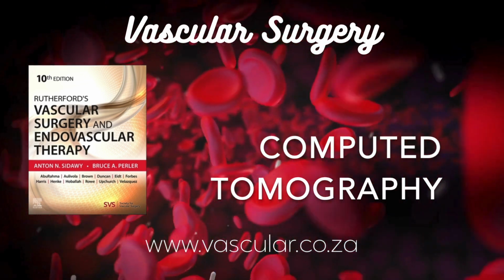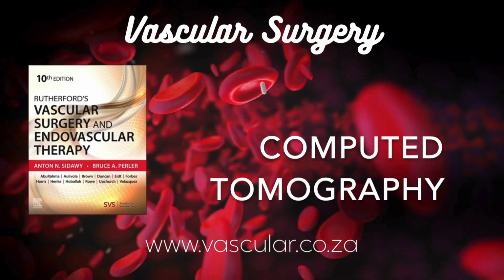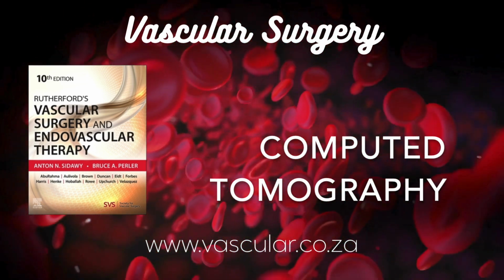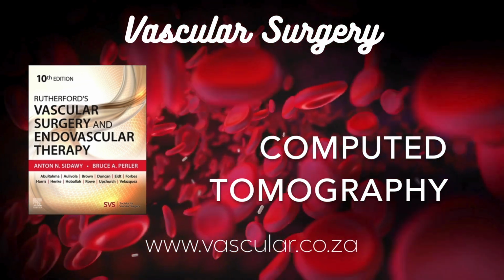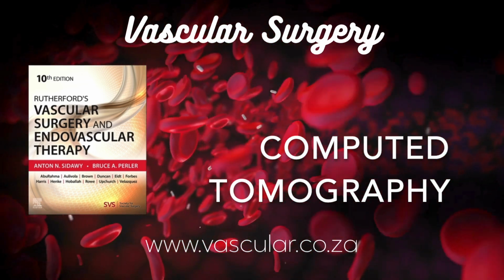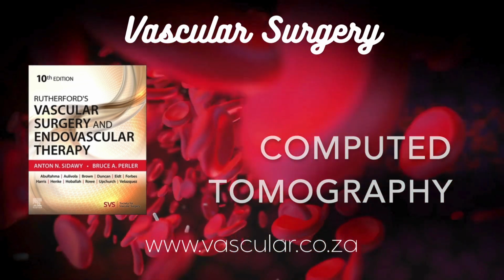Gotcha. Like using shallow depth of field in photography, blurring the background to focus on the subject. Exactly like that. It was a big improvement, used for years. But the real revolution came in the 70s. Right, that's when computers started getting powerful enough. Precisely. That, combined with the idea of transverse axial scanning, basically scanning across the body slice by slice, and then using computation to reconstruct the image, that's where computerized axial tomography, or CT scan, came from. Which we mostly just call CT now.